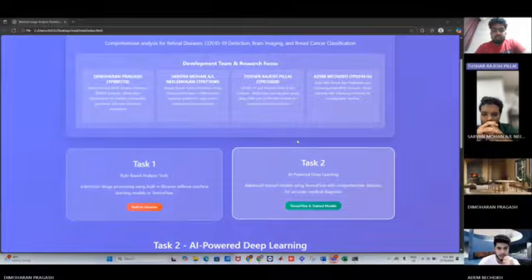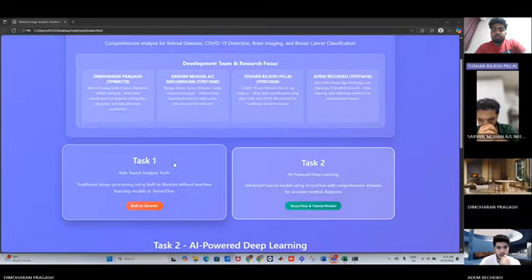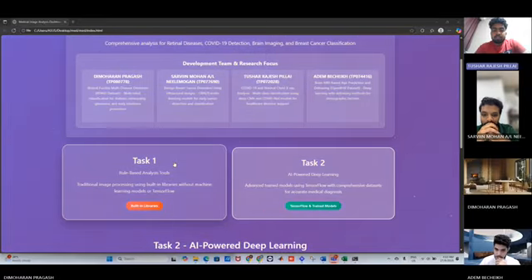So, the challenges we faced. Data imbalance is a big issue, with more normal or non-COVID images than positive COVID images. Some images have varied quality that may come from the X-ray machine, different sources, and even noise. This model is not yet clinical grade. Explainability is useful, but we cannot replace medical professionals.